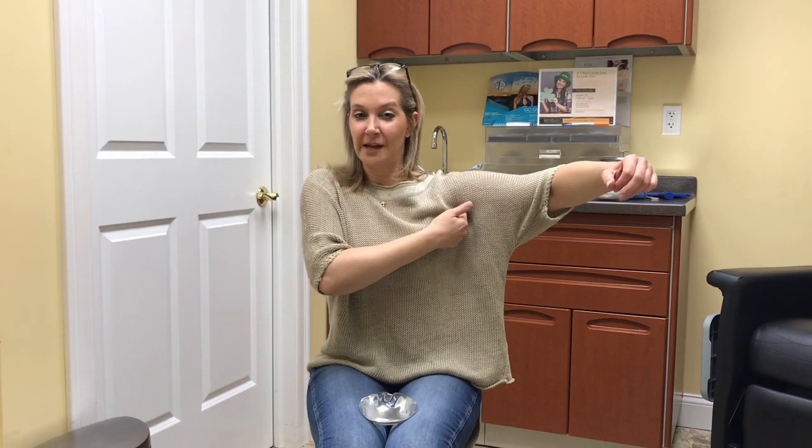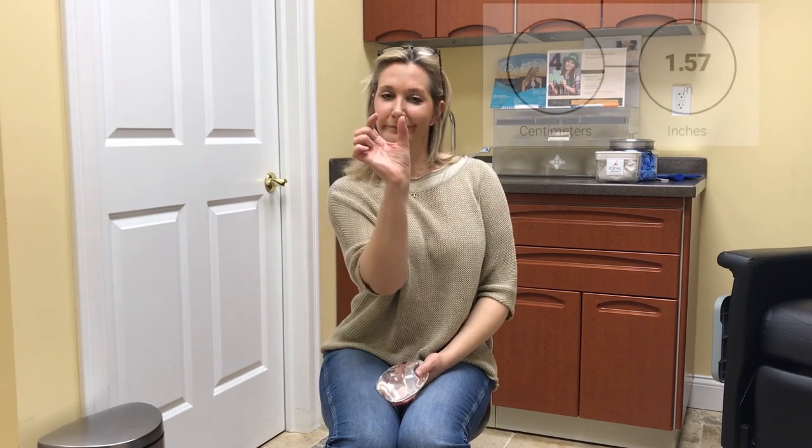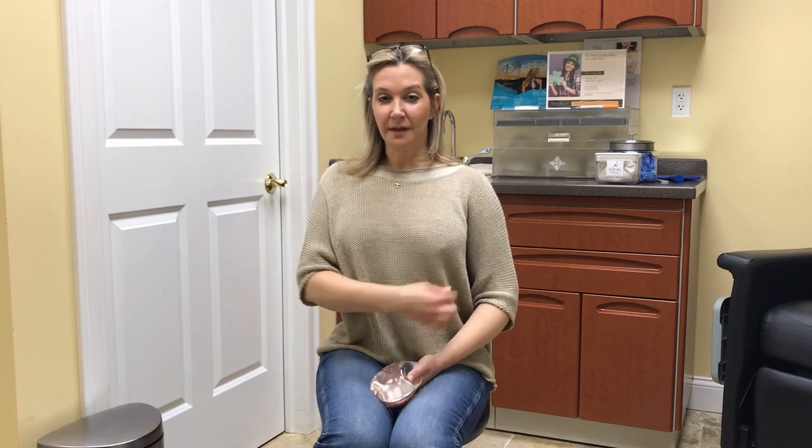The other 3 incisions that are out there and viable: one underneath the armpit, one around the nipple, and one just underneath the breast here. In all cases with gel implants, the incisions are about 4 centimeters long. They're not long, and they tend to disappear. My favorite is the one underneath the breast. The reason for that is it decreases capsular contracture. It is a much easier direct visualization of the pocket, so you can get it just right, and that is the key to the surgery, getting the pocket right.